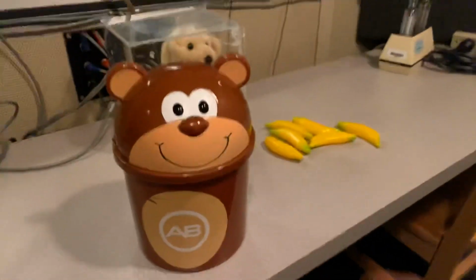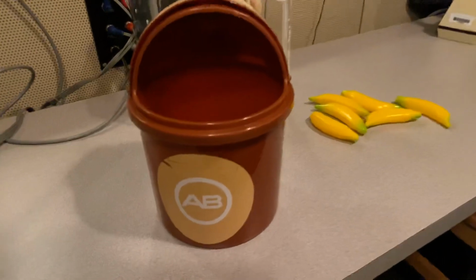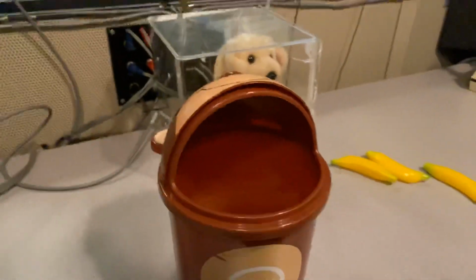So I have this little toy right here. I call him my monkey bear. Doesn't it look like a bear to you? I think it does, but monkeys like bananas, so I don't know. At any rate, so tweet, throw it in the bucket. Yum. You got to make it fun for the kids. Tweet, throw it in the bucket, okay? Keep doing it until you know that the kid's got the game down. Tweet, throw it in the bucket, okay? And then have them hold it at their ear, and you don't help them. You play the tone, and they throw it in on their own. And if they do it, you know that they heard the tone.